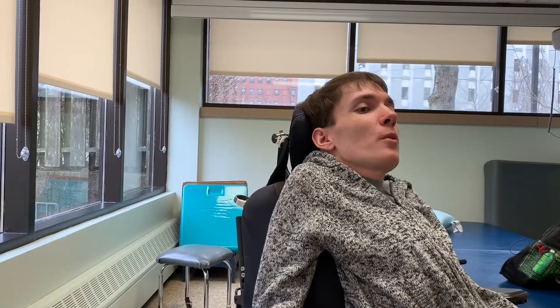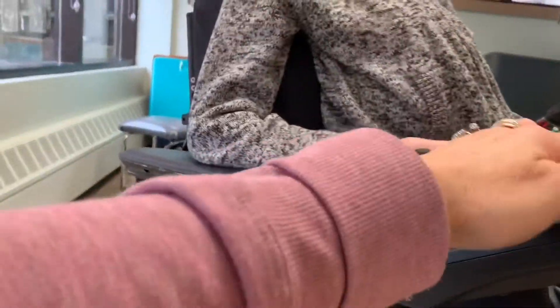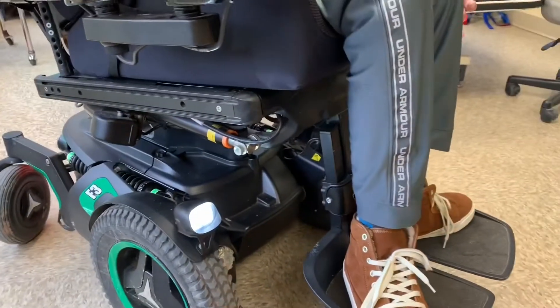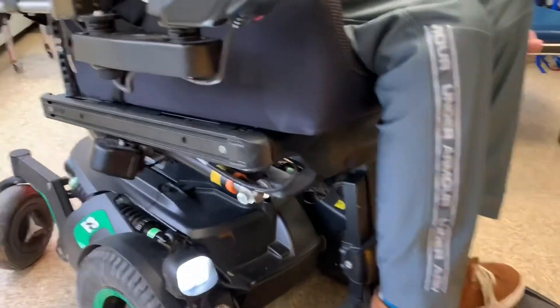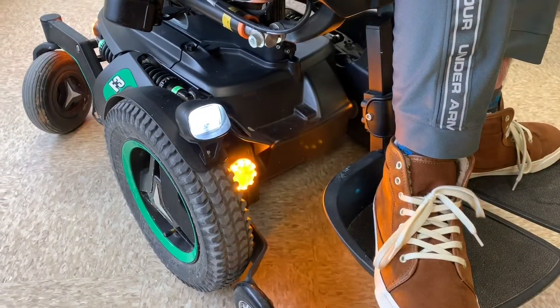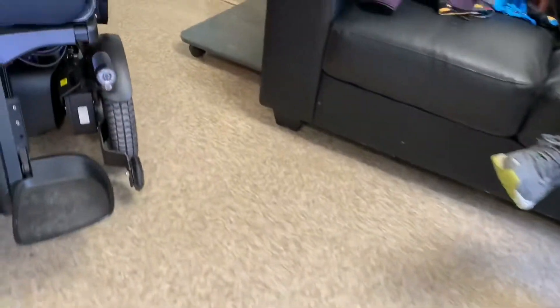The light kit on my chair is pretty cool, so I'll give you a quick demo of mine. I'm just going to come over here and light up this chair. So that's what my lights look like in the daytime. And here's what the hazards look like on mine. As you can see, we've got a whole light show going here. If you look on the back of mine, the new chair has a pretty unique feature — here's your daytime, your daytime running lights.